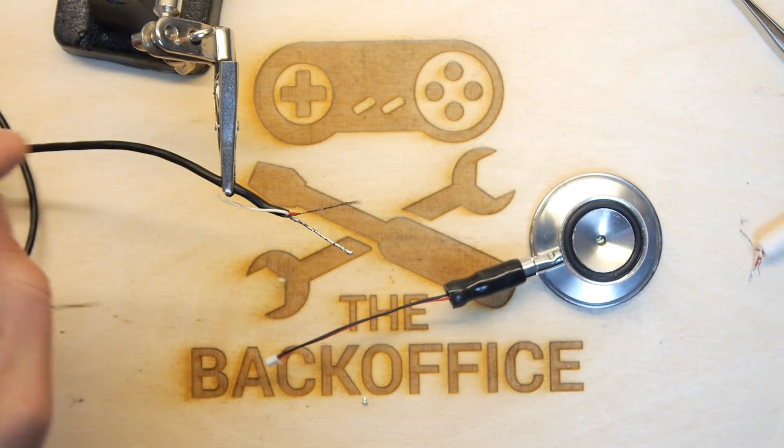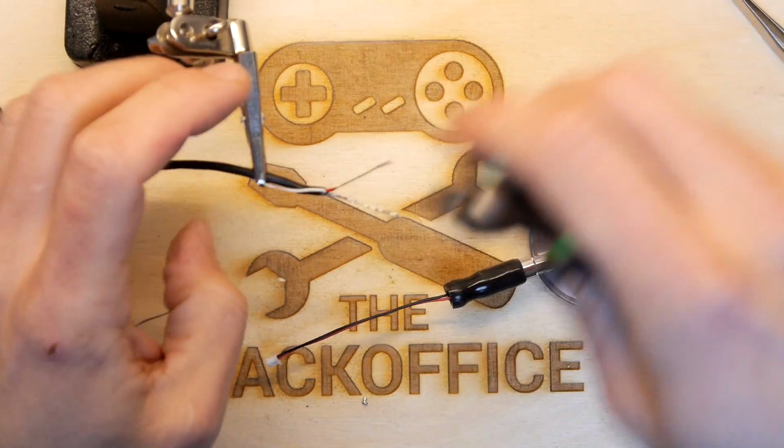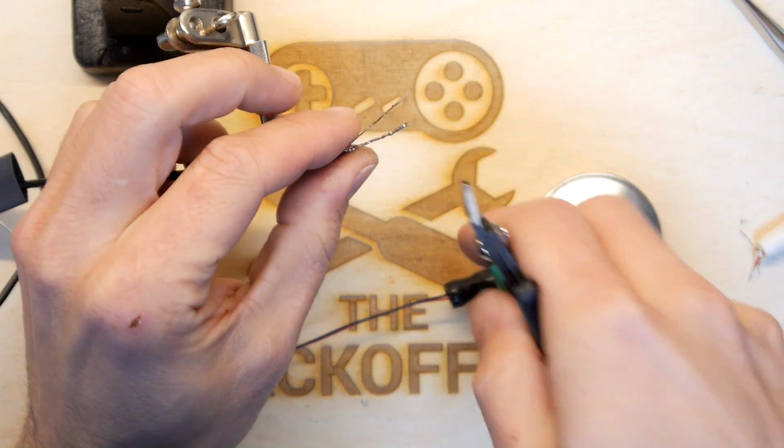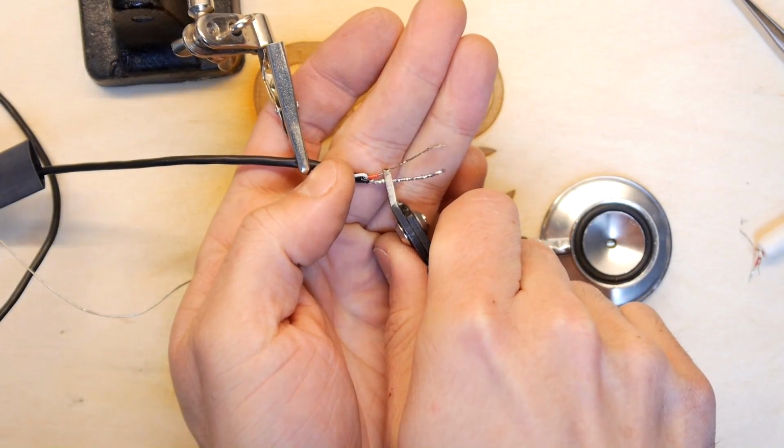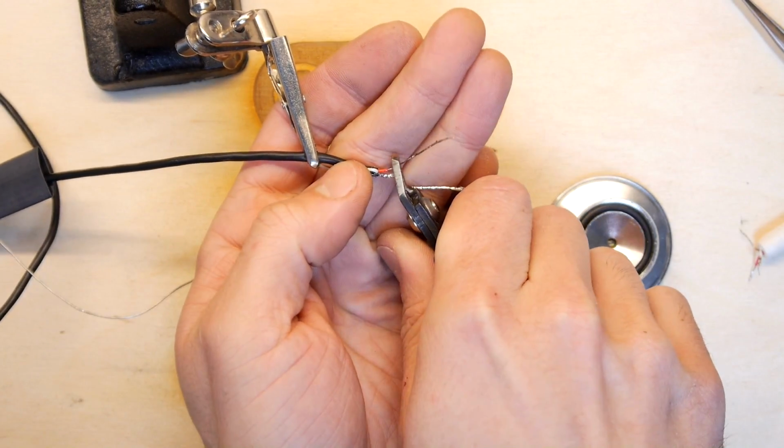I'm not going to cut it though, because I might want to use it in the future, so I'm just going to keep it under the heat shrink somewhere. So I want these both the same length. I'm just going to snip them right there. About a mil. Mil of play.